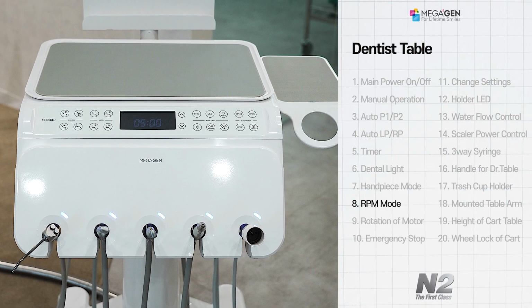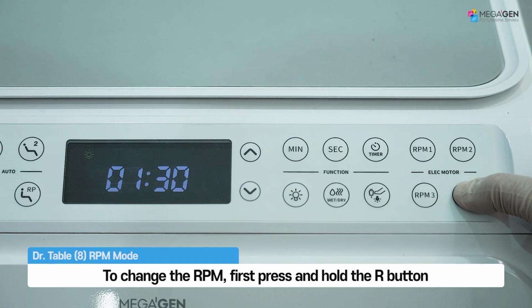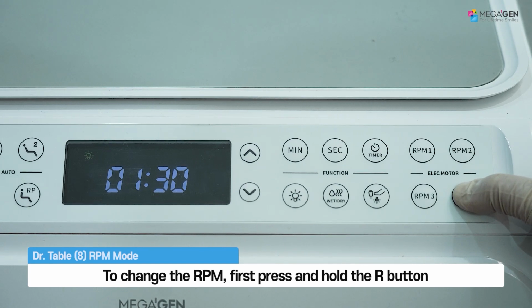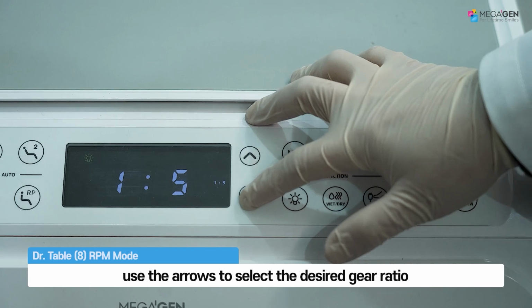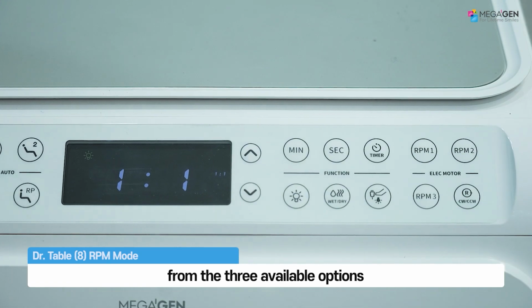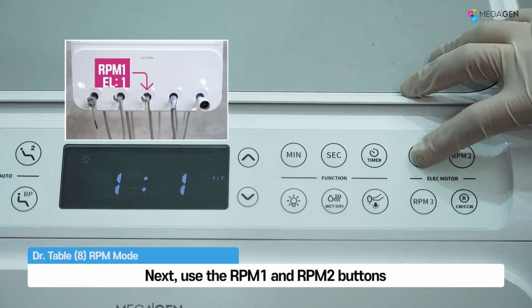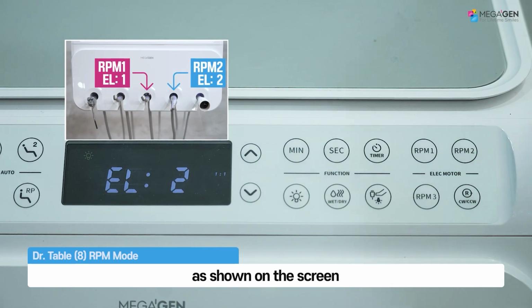RPM setting mode for electric motor use. To change the RPM, first press and hold the R button. When the current gear ratio is displayed on the screen, use the arrows to select the desired gear ratio from the 3 available options. Next, use the RPM1 and RPM2 buttons to select the motor position you want to use, as shown on the screen.